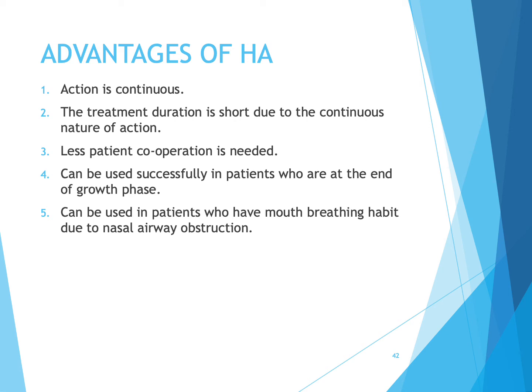The following are advantages of the Herbst appliance. The action is continuous because it is a fixed functional appliance and is cemented to the teeth. The treatment duration is short due to the continuous nature of action. Less patient cooperation is needed. It can be used successfully in patients who are at the end of the growth phase, and in patients who have a mouth breathing habit due to nasal airway obstruction.